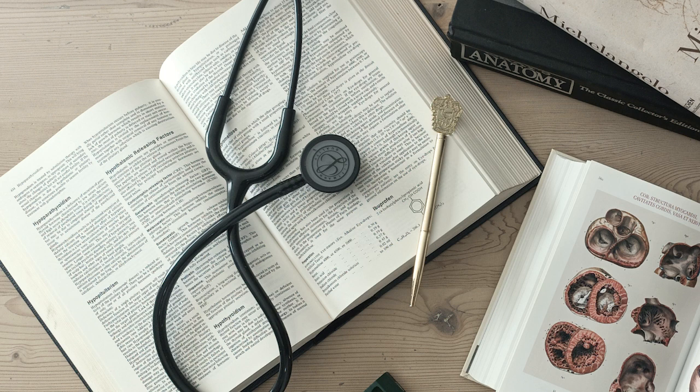So those are atrial premature contractions originating above the ventricles. Now let's move to ventricular premature contractions, or VPCs, or PVCs. How do we identify these on an ECG, and what are their characteristic features?